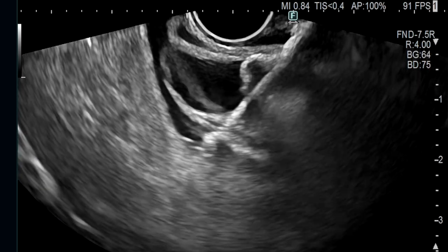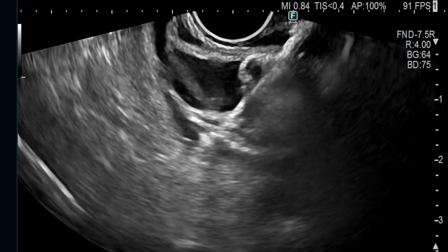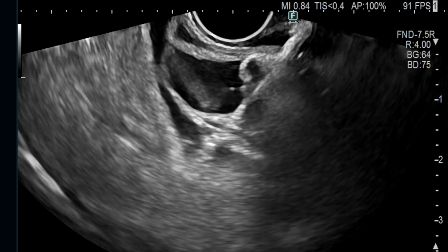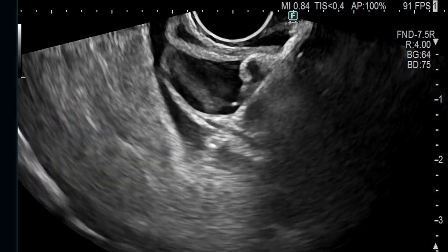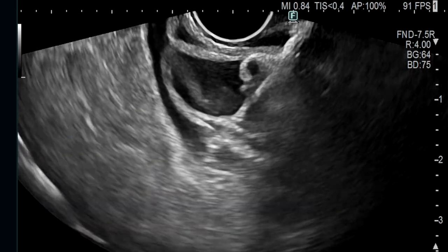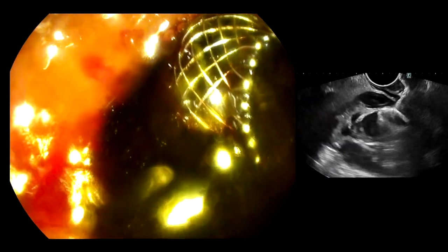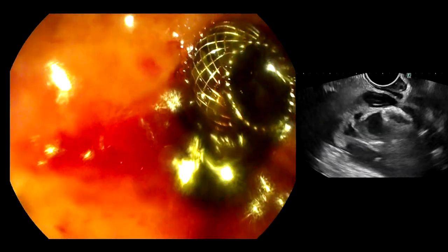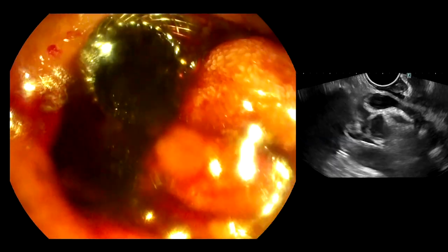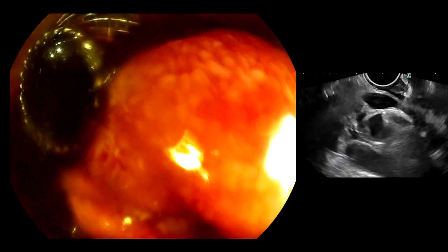The stent size used in this patient was a 6 mm diameter stent with an 8 mm saddle length. After deployment of the distal flange within the bile duct lumen, the proximal flange was then deployed within the scope channel and pushed out into the duodenal lumen.